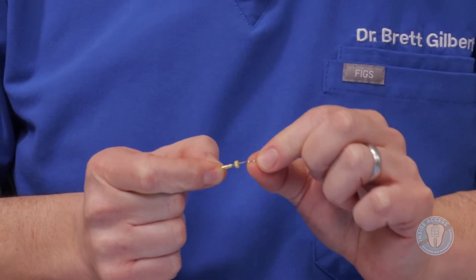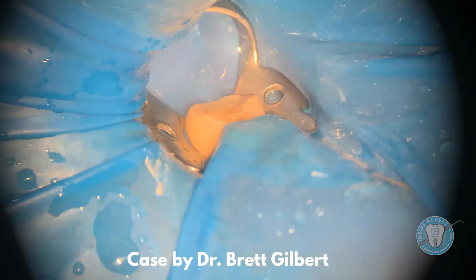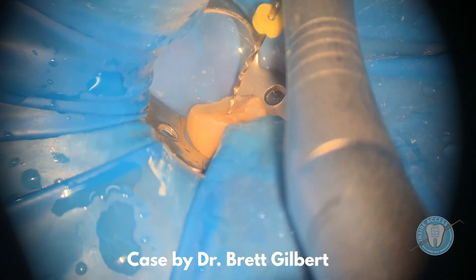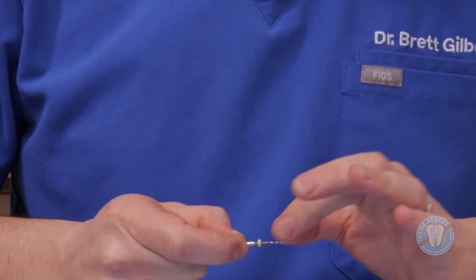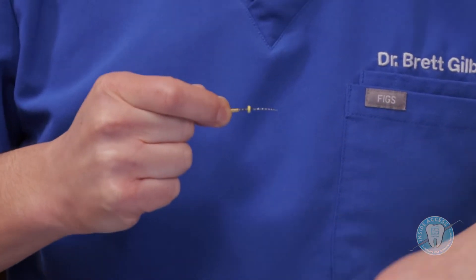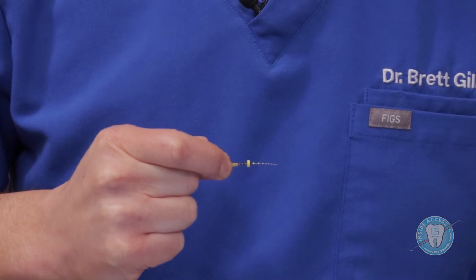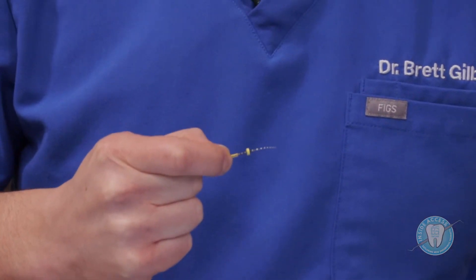Once I've established this 2004 at the tip, I'm going to continue to apically enlarge, moving into the 2504. As you get higher in size in the Zenflex system, you're going to incorporate a little more controlled memory. Controlled memory is a really cool feature that's been enhanced within these files by the heat treatments they use. Each file system has a different type of proprietary blend, but these instruments, if you notice up close, have more of a purple hue. This purple represents the very proprietary heat treatment that does incorporate this controlled memory.